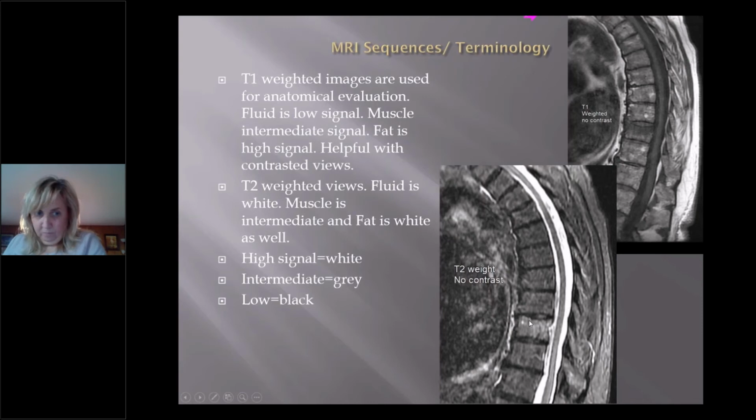That's a fracture, and that's a compression fracture. If we look at the line going straight across, it's nice and straight across, and we see this dip in there. That's a superior end plate fracture, and it has high intensity on T2, low intensity on T1. It's there on two different signals. That is absolutely unequivocally an acute compression fracture.